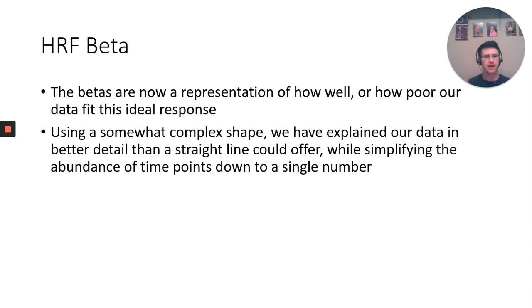It gives us more variety, but it also simplifies the statistical method, because what you would have had to do in many respects is compare each time point in one condition versus each time point in another condition. And you have an enormous amount of comparisons. Again, that 30-second window at 10 hertz, you're comparing 300 time points against 300 time points. And each time you do a comparison, you're more and more likely to basically mess up your statistics. It's typically type 1 error, but you're more likely to get screwy results.